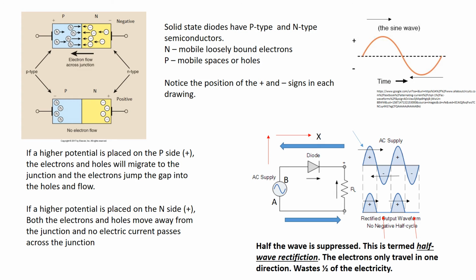Well, what do electrons do? And these are the electrons that are in the N-type semiconductor. If you put a positive charge coming in, opposites do what? They attract. So the positive is going to attract the electrons. The negative, now remember I said holes aren't exactly positive charges, but think of them kind of like that, in that they're pulled toward the negative. And now notice that you do not have any electrons that are going to jump across from the N to the P. So notice what it says at the bottom. No electron flow.